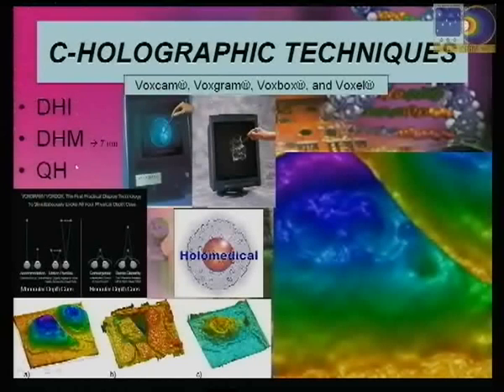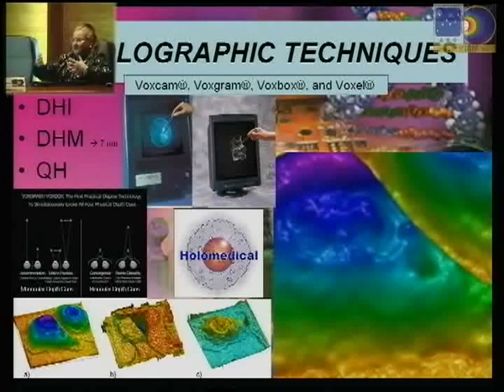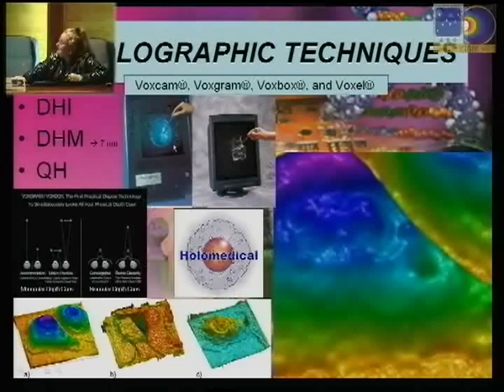What is interesting for some medical applications of the holography is that you correct a lot of viewing problems of the area. So you correct for depth of the image, you correct for lateral deformation, lateral vision, and therefore in some areas, like for example in breast, or even when you are planning surgery in the spine, a holographic imaging display on particular monitors such as this one could be of interest.